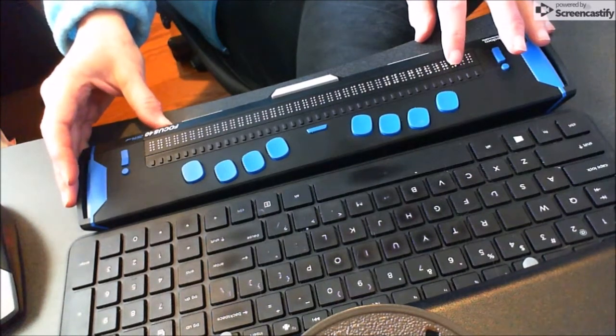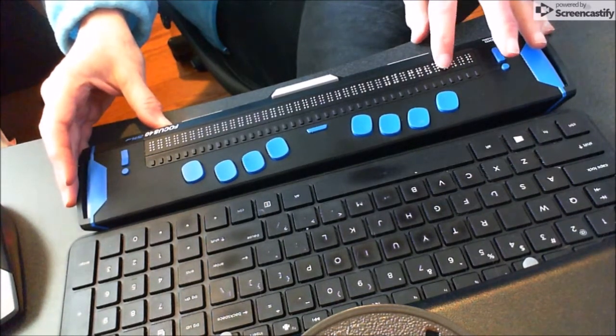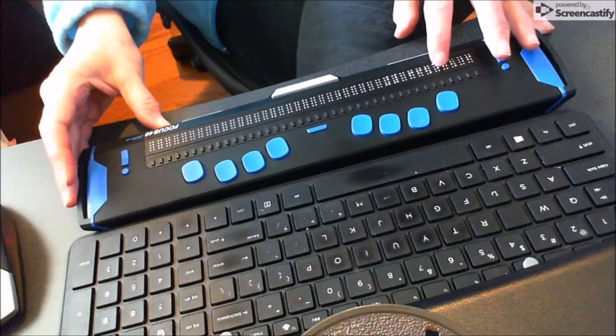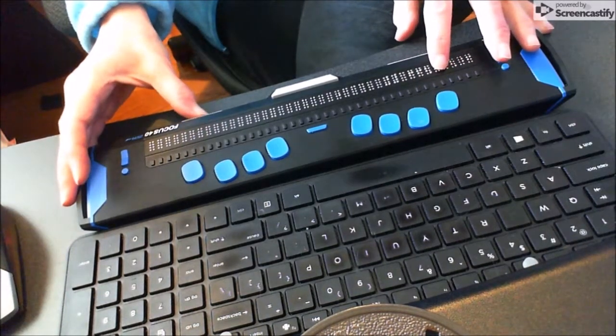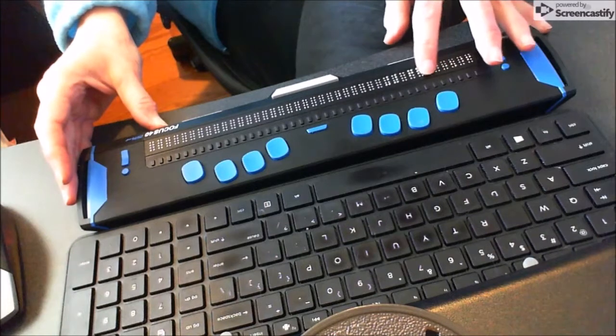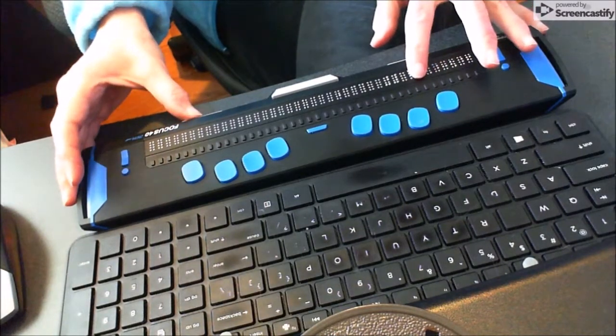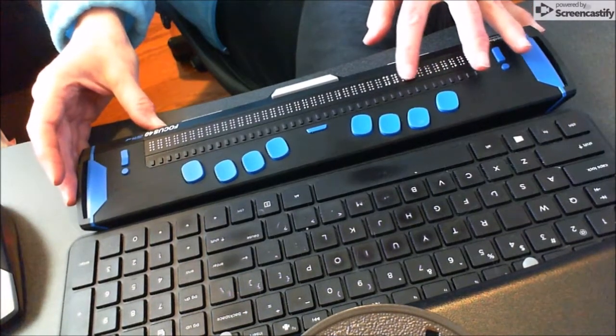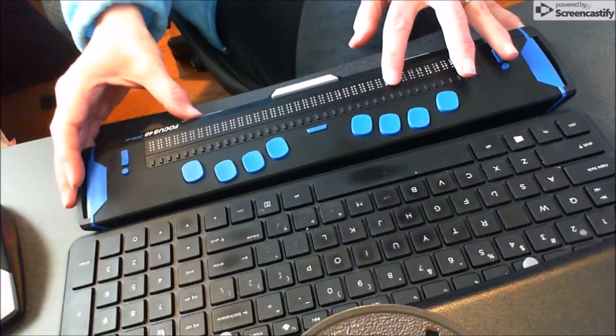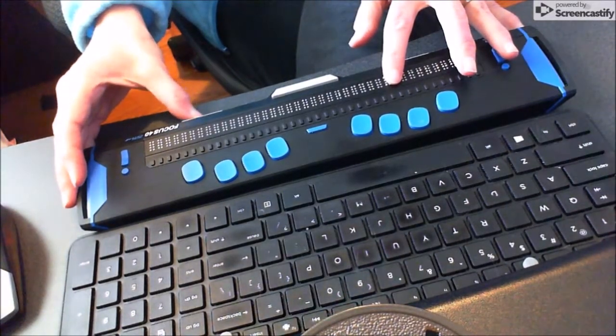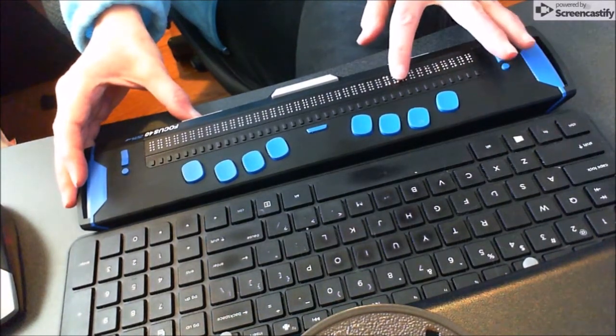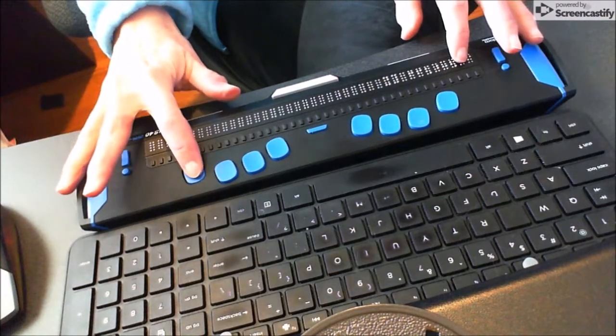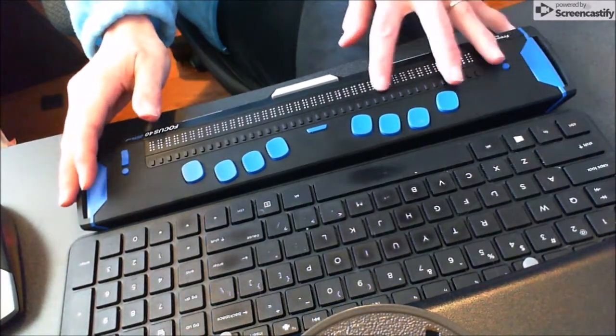Move to the next one by hitting your right panning button. You've got your minutes, and you set them with your rocker button. Hit your panning button, set your seconds, hit your panning button again. You've got PM and AM, which you can set with your rocker buttons. Make sure you confirm that with dot 8.